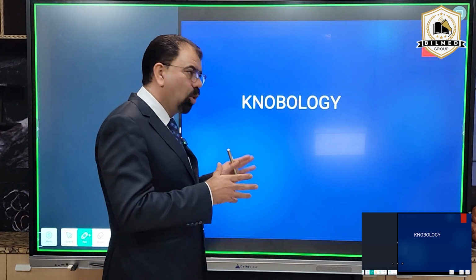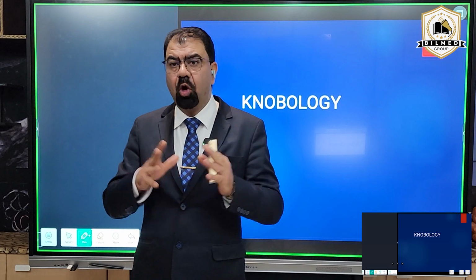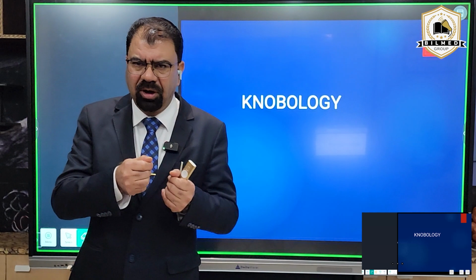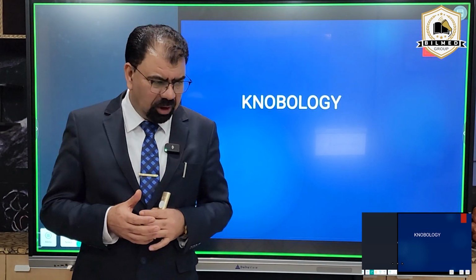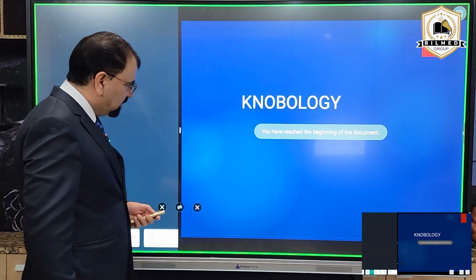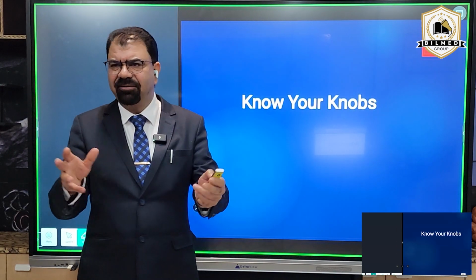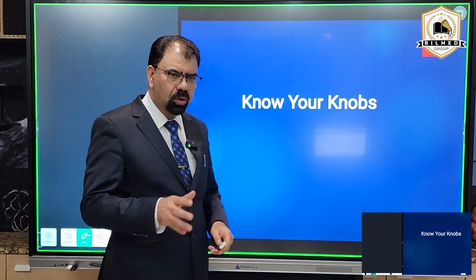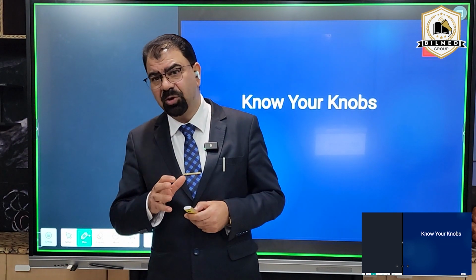So, Dr. Madhuri, knobology. First point, there are many knobs in your machine. And the more money you spend on the machine, the more knobs you will get over there. Dr. Madhuri, let's discuss these knobs. Tell me frankly, are you using each and every knob, whatever is provided in your machine? No, sir. Now, tell me honestly, why you are not able to use all the knobs?